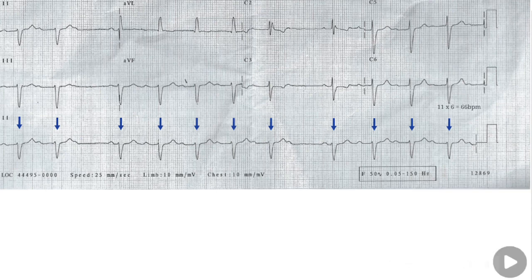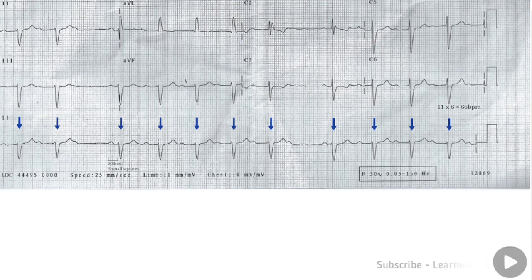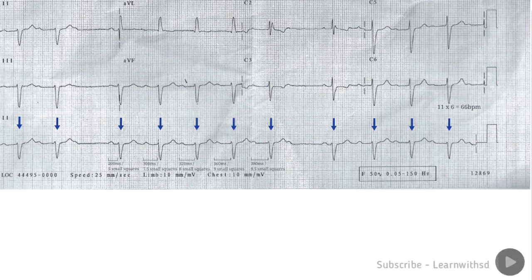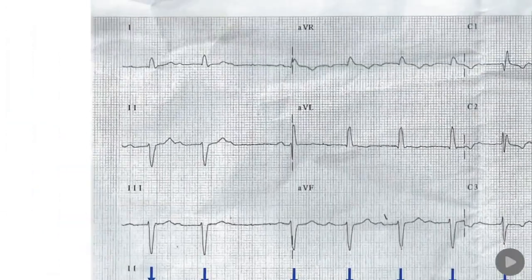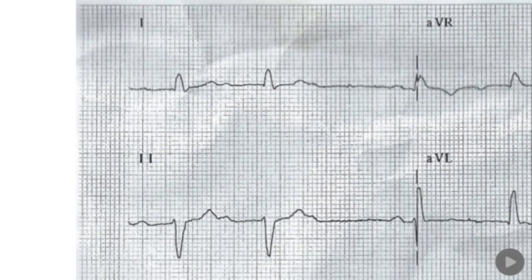With each conducted beat the PR interval is prolonged. Eventually the next P wave is not conducted, then there is a pause, and then this same pattern repeats. This is the classic Wenckebach pattern.